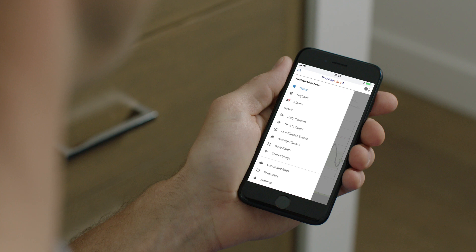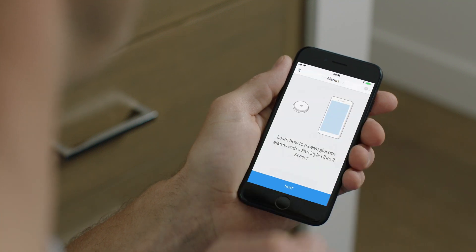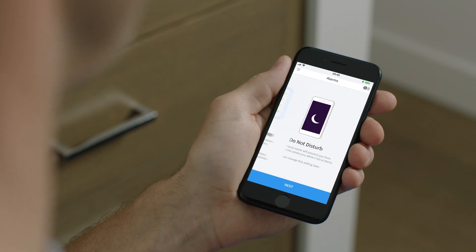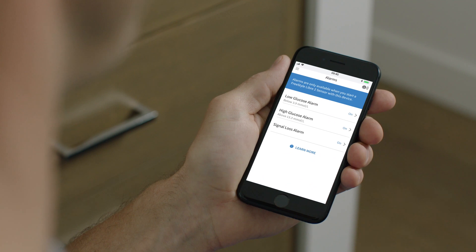Setting up the alarms in the Freestyle Libre 2 app is easy. After opening the app on your phone, tap Alarms in the menu. There are three alarms: low glucose, high glucose, and signal loss.